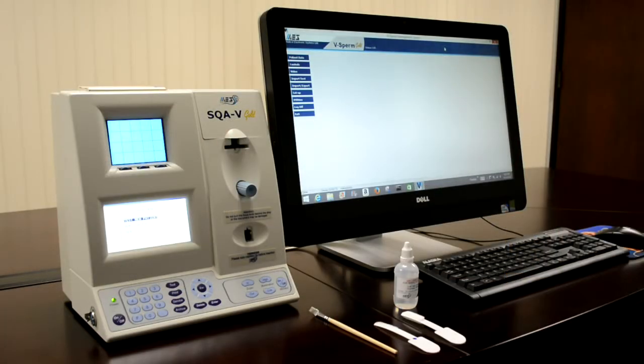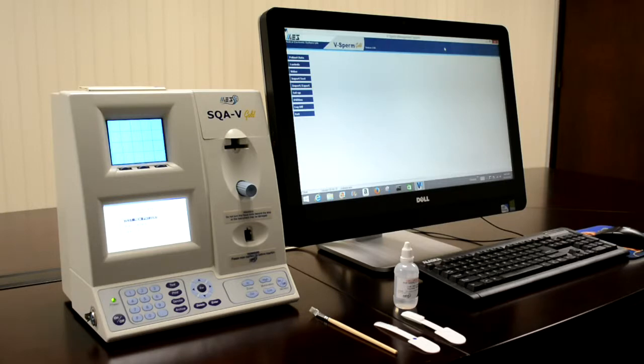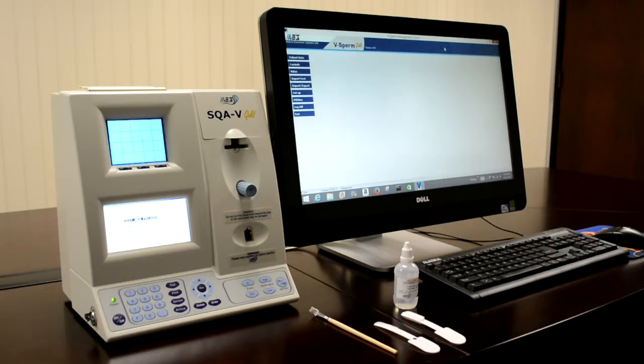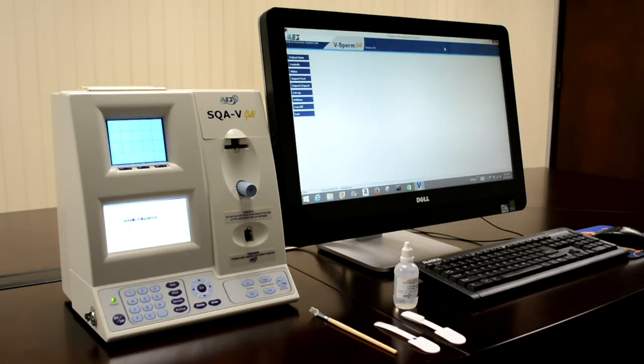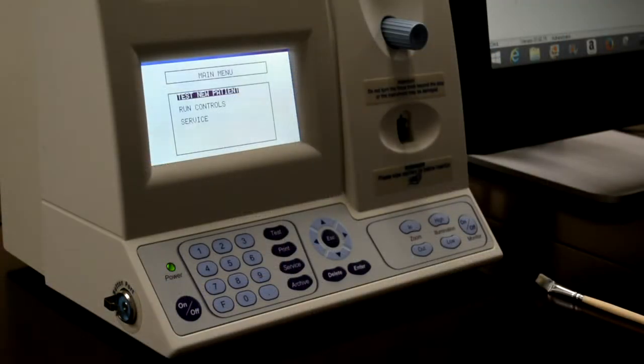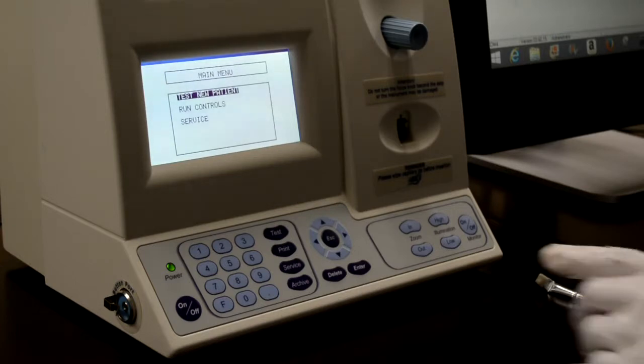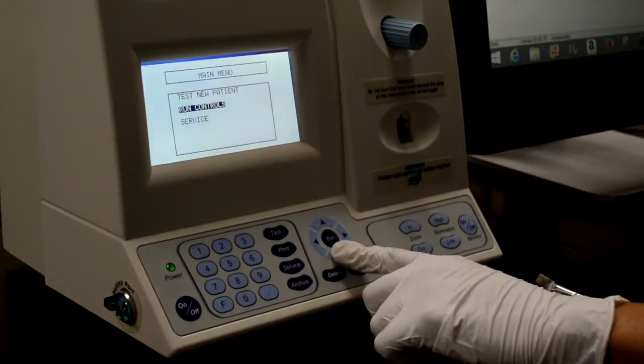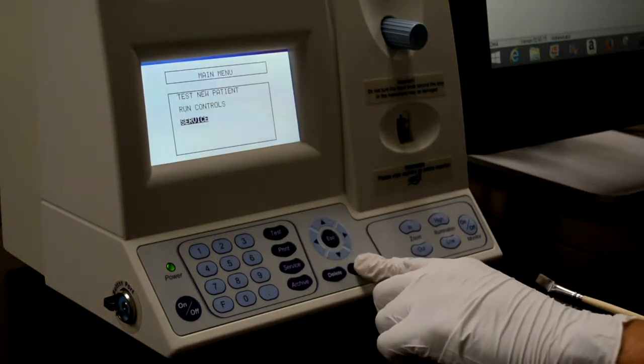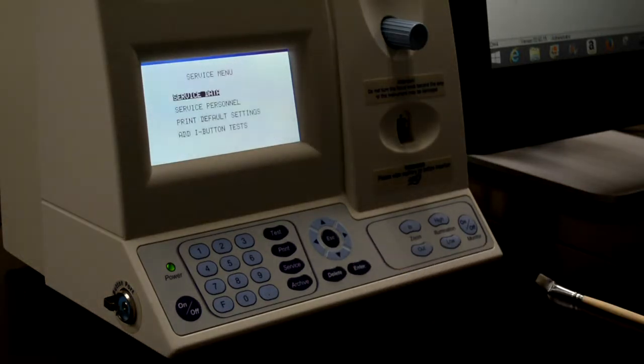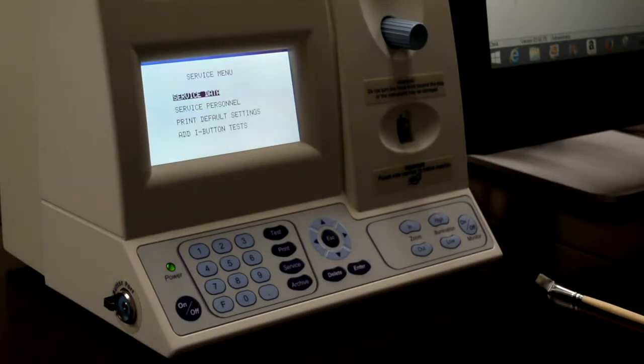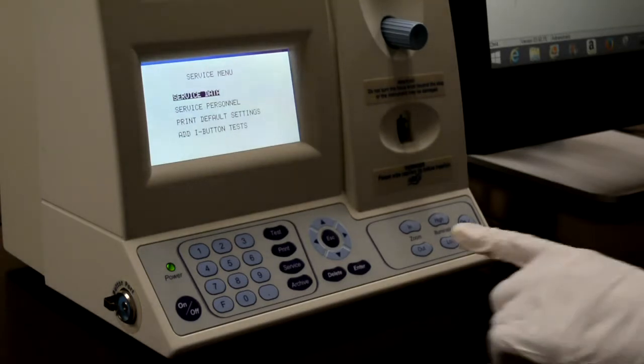As a first step, we'll take a look at the recommended daily cleaning procedure. It's recommended that you activate the service data screen on the SQAV, and from the utilities tab in vSperm, activate the real-time service data so you can view key reference parameters. To view the real-time service parameters, select service from the main menu, then select service data.